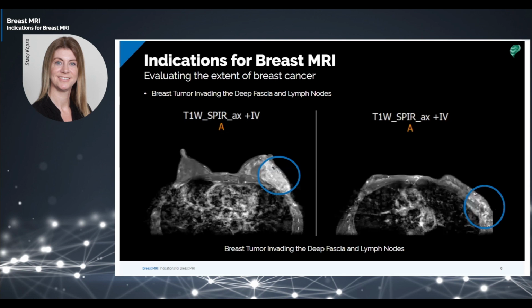After the detection of breast cancer in a mammogram or breast ultrasound, MRI is useful in determining the extent of invasive ductal carcinomas and detection of multiple lesions and presence of lesions in the contralateral breast. MRI determines disease extent more accurately than mammography and physical examination in patients. The extent of the disease is evaluated through detection of multifocality and multicentricity. Invasiveness is assessed by looking at the deep fascia, which includes the pectoralis muscle and intercostal muscles.